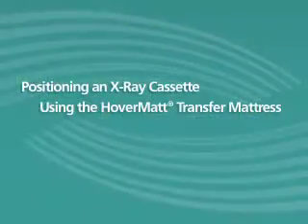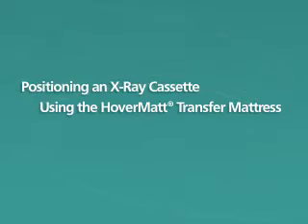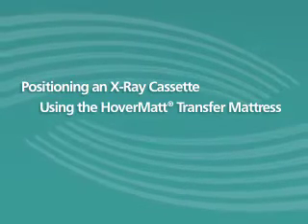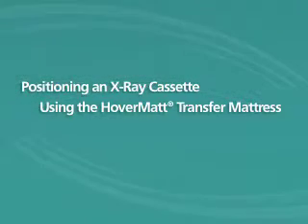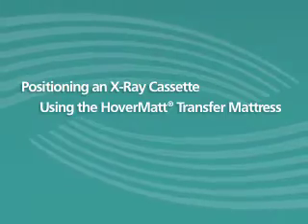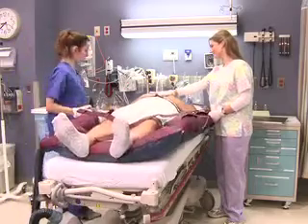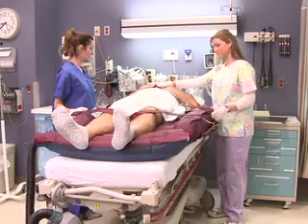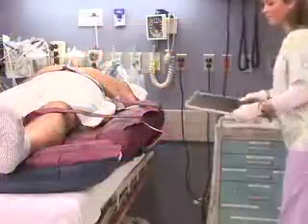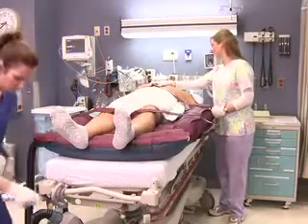Because the HoverMatt is radiolucent and artifact-free, it can be used to make the positioning of a portable X-ray cassette under a patient easier for the caregiver and more comfortable for the patient. If using a metal-rimmed cassette, cover it with a pillowcase to avoid tearing the HoverMatt during cassette placement. Inflate the HoverMatt. While a caregiver remains close to the patient for safety, the X-ray technician performing the X-ray should inform the patient of the task and then insert the cassette under the inflated HoverMatt at the desired location. Deflate the HoverMatt when the cassette is in position.